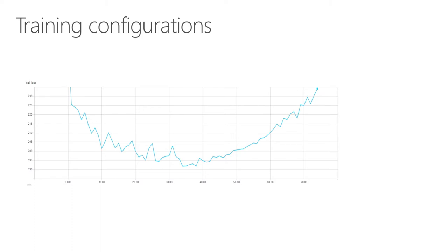So then here's another question. What did you write this in? Did you use something like TensorFlow or Keras or something else? Yeah, currently we use Keras with TensorFlow at the backend. Fantastic. Okay, so once you've gone through the process of weeding out the bad data, augmenting the data, and coming up with a suitable model, making sure the learning rate and the optimizers were good, because I'm sure you ran it the first time and it didn't work, and then you're like, maybe we should do these smart things to the learning rate. Maybe we should use the Adam optimizer.